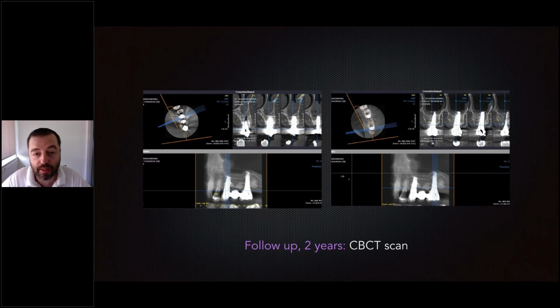So basically we had in the same case two minimally invasive approaches. One was, let's say, vertical augmentation without raising flaps, and then we raised a little bit internally the sinus membrane, such as we can place a longer implant here, just to have a comparison.